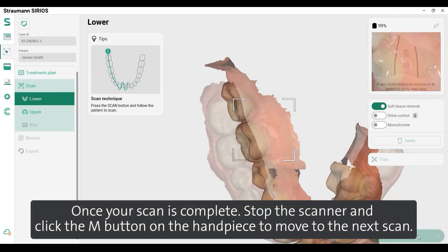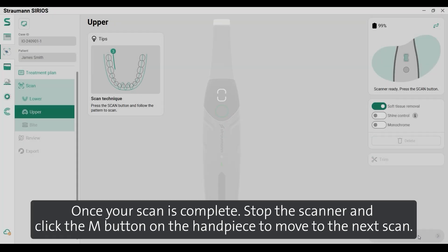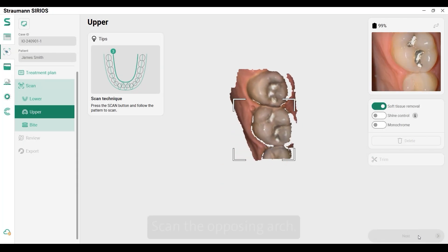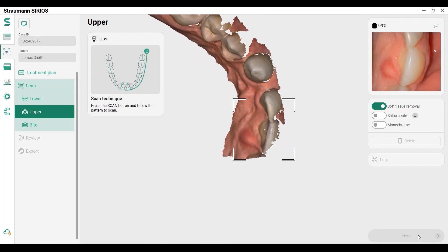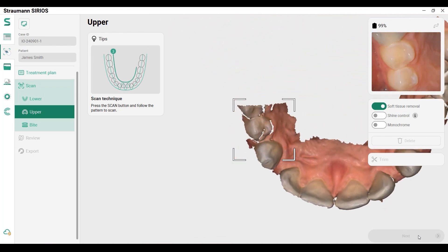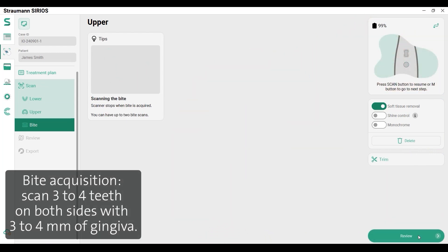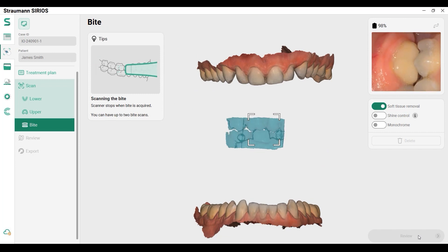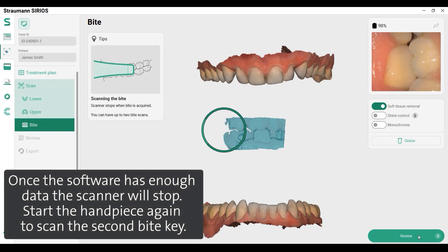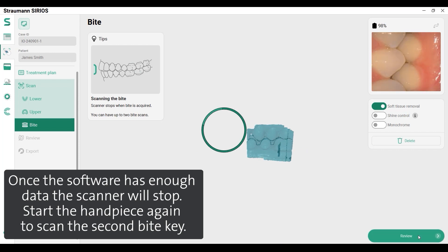Once your scan is complete, stop the scanner and click the M button on the handpiece to move to the next scan. Scan the opposing arch. For bite acquisition, scan 3-4 teeth on both sides with 3-4mm of gingiva. Once the software has enough data, the scanner will stop. Start the handpiece again to scan the second bite key.